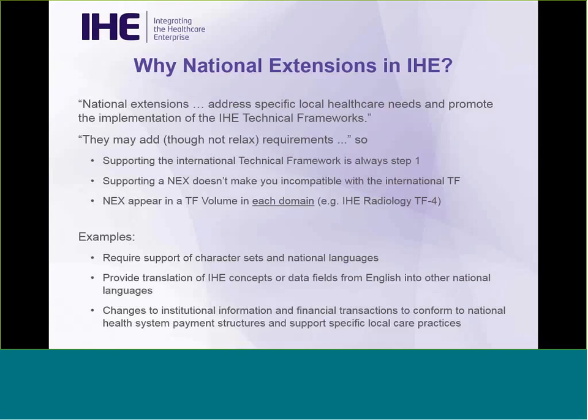The idea with most IHE profiles is we want them to be international, so you can use the profile anywhere, and we try to make the profiles sufficiently flexible that they work within all the different healthcare systems. That being said, there are a few things that are local needs or local implementation requirements, and so we try and encapsulate them in national extensions.